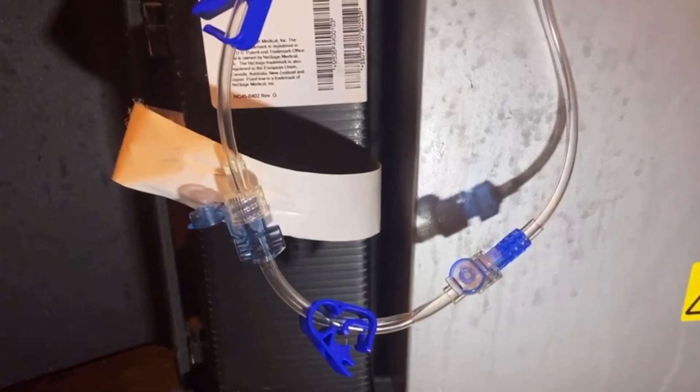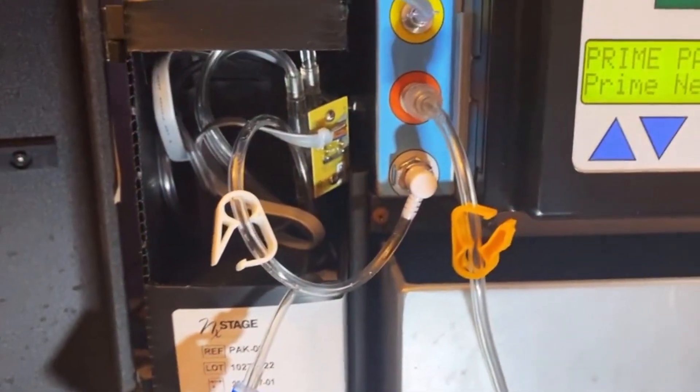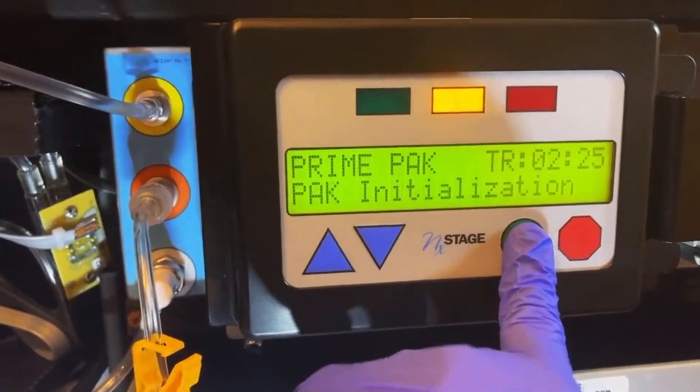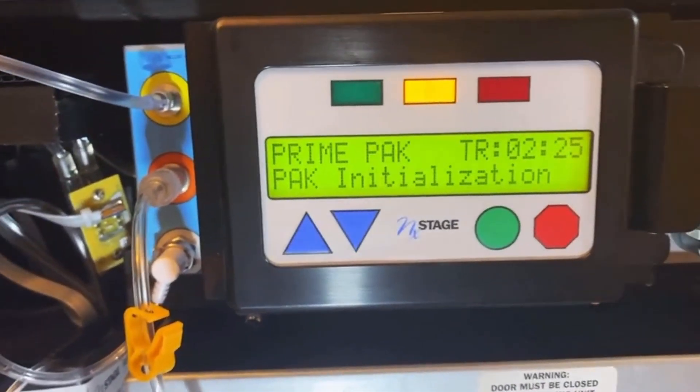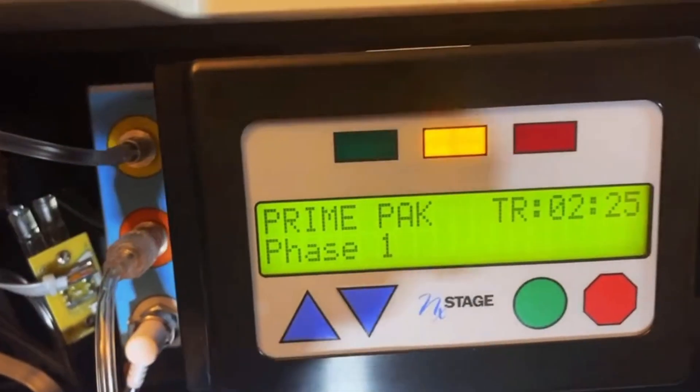Connect the dial connection and make sure all the clamps are open. Press start for PAK initialization — and you're off. The priming cycle takes 2 hours and 25 minutes.